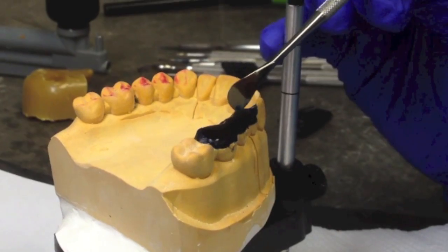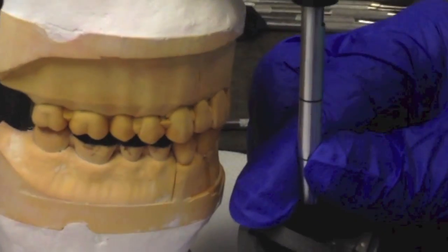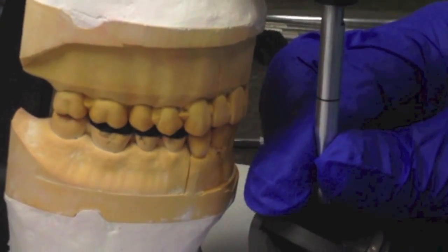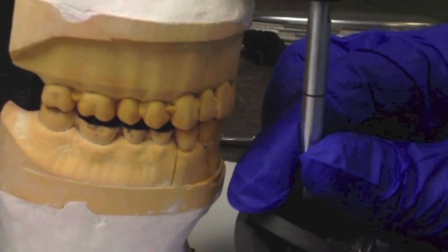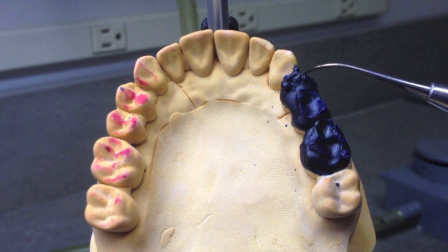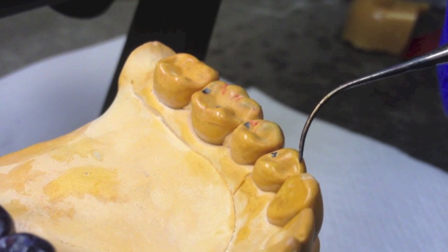Once the platforms are brought to the occlusal table, close the articulator and move into left and right lateral excursions as well as protrusive. When putting the articulator into centric occlusion, the functional cusps of the mandibular cast make these indentations.